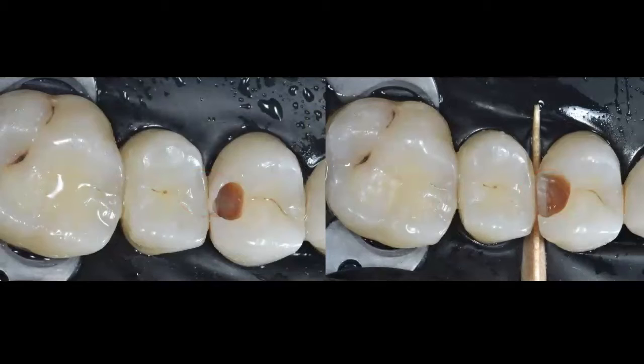or maybe switch to a 245 or a 330 burr, any burr that you're used to using for these types of situations. What I try to do is push my burr towards the proximal wall of the affected tooth, as you are seeing in the left photo on the screen. I'm trying to push my burr towards that affected wall so that I can make that wall as thin as possible.